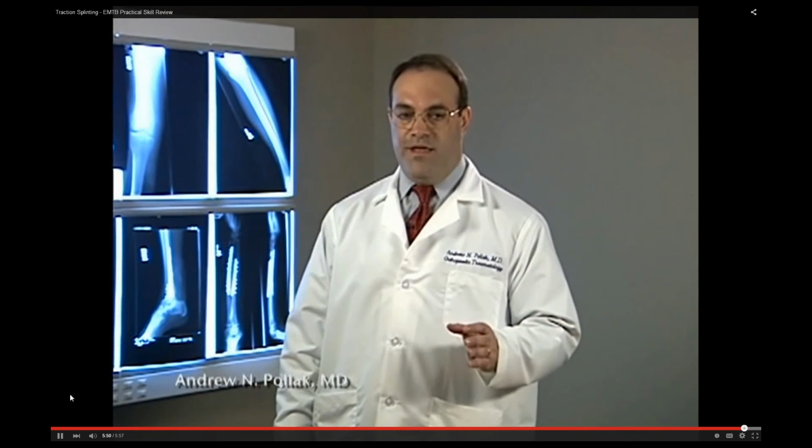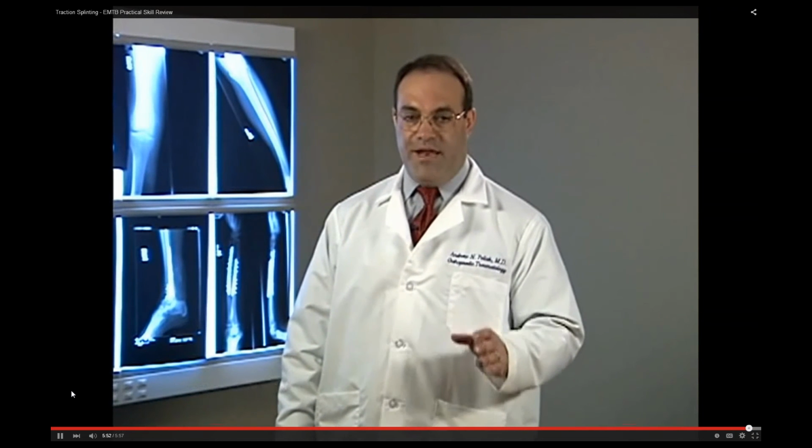Direct your partner throughout each step. Once applied, maintain manual traction until mechanical traction is applied and all straps have been secured.